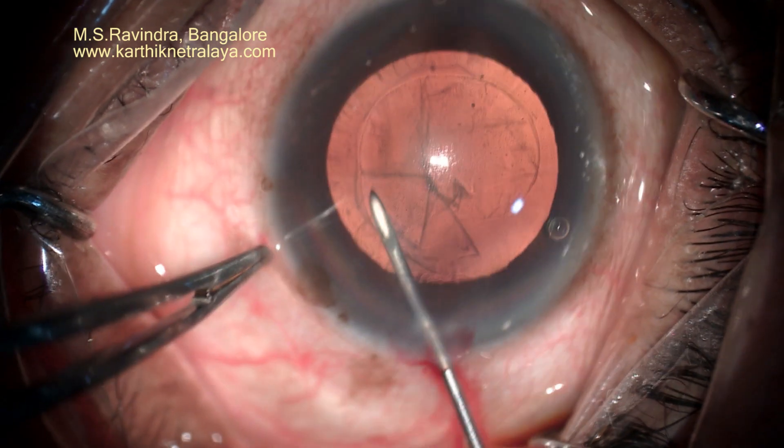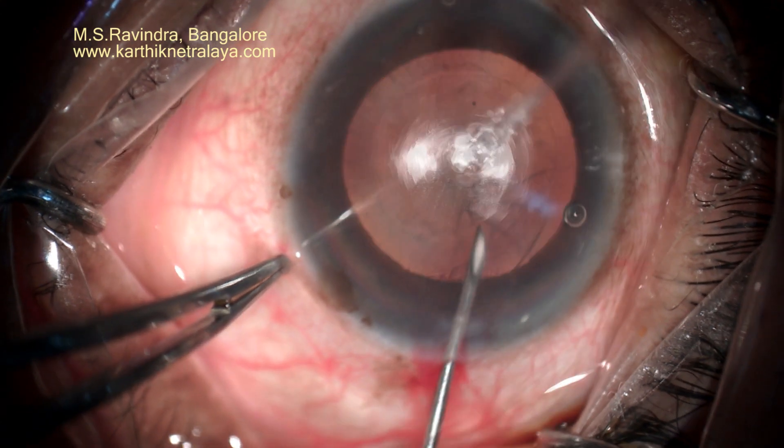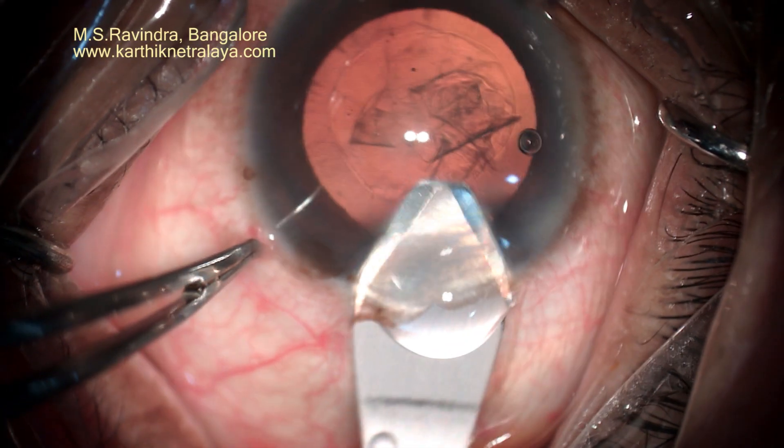The advantages are that the chamber is kept deep throughout, and there is no visco leak that usually happens otherwise through the tunnel. A deep chamber facilitates absolute control while you are doing the rhexis.